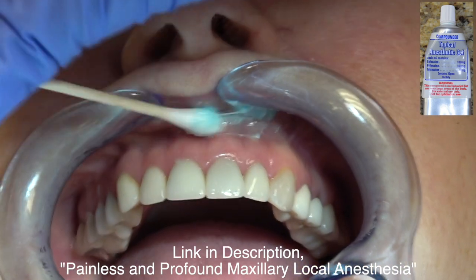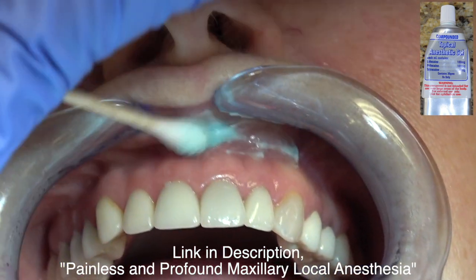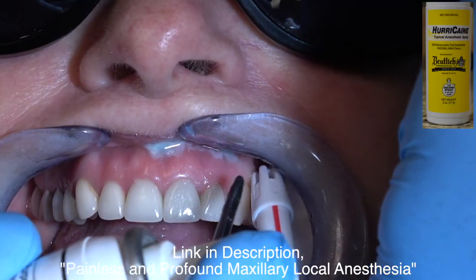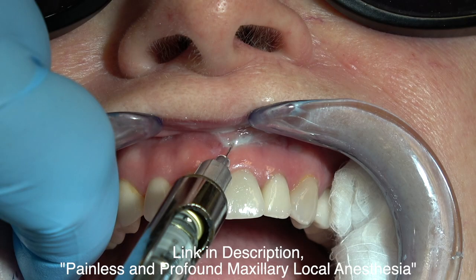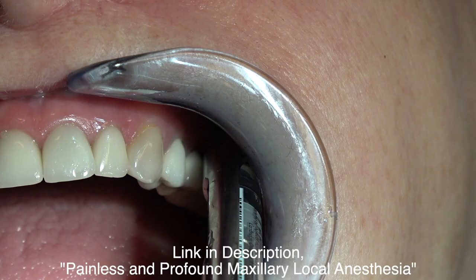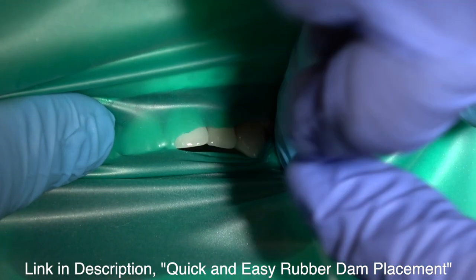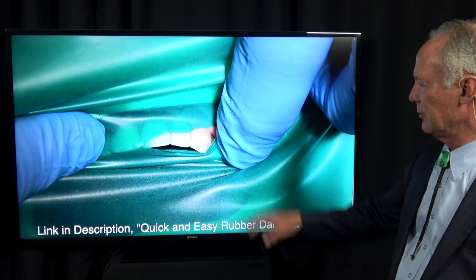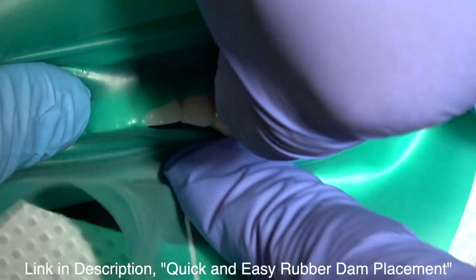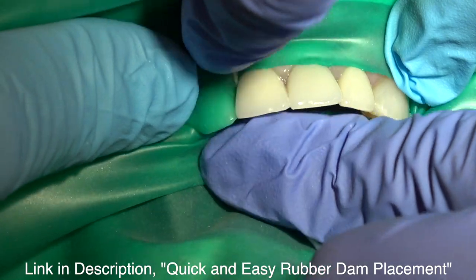This is before and after of placing topical anesthetic. You can watch all these videos in the library of DentistryMasterClasses.com. The tooth is non-vital, so it's not going to be painful, but you certainly want to anesthetize the gingival tissue where you're doing the apicoectomy.